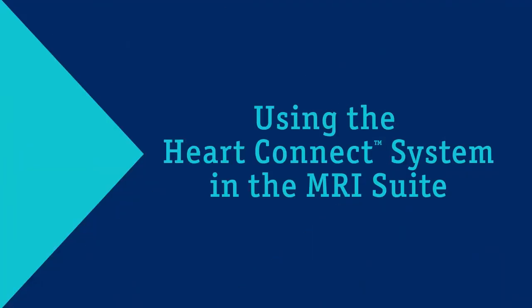Hey, I'm Justin with Boston Scientific, and I'm going to show you how we can utilize HeartConnect in the MRI department to remotely program a pacemaker.